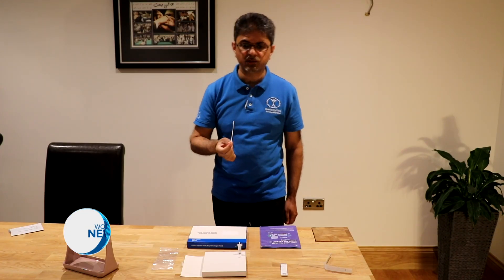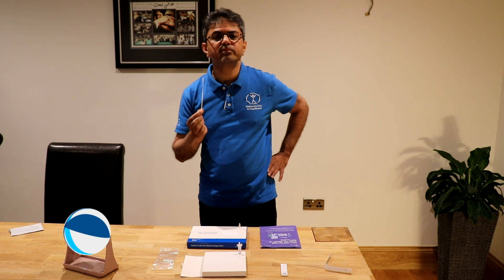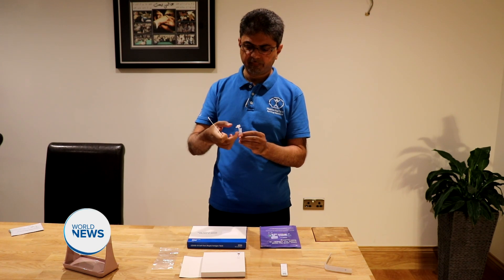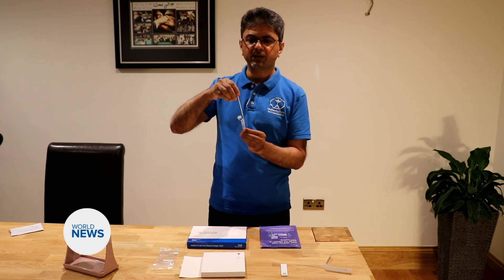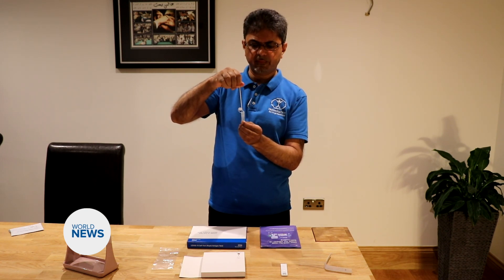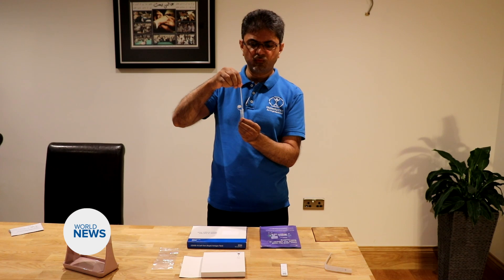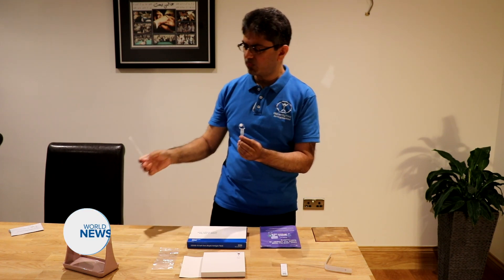Without touching anything else, remove the swab — it's important that the fabric tip does not touch anything else. Now we're going to process the sample. Place the fabric end of the swab into the extraction tube and rotate for around 15 seconds. Pinch the tip of the extraction tube to ensure adequate buffer around the swab, and as you remove the swab, pinch the tip to remove any liquid. Dispose of the swab.